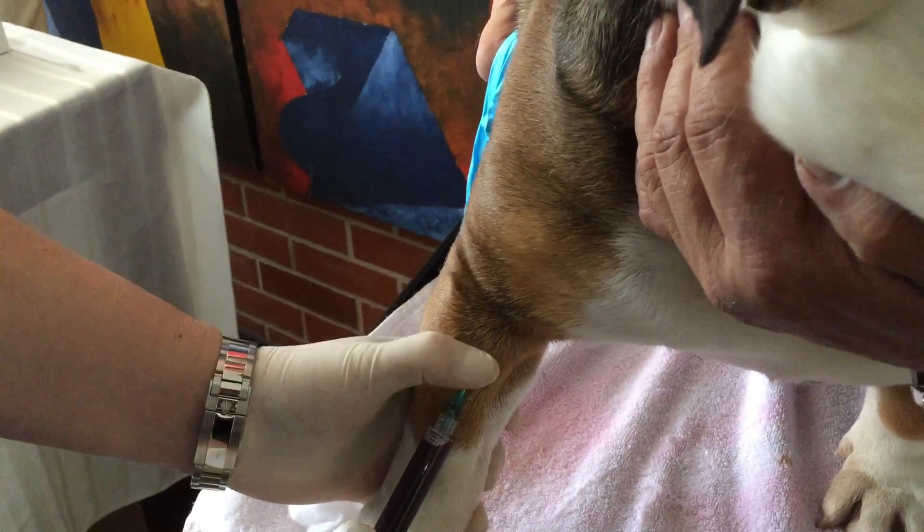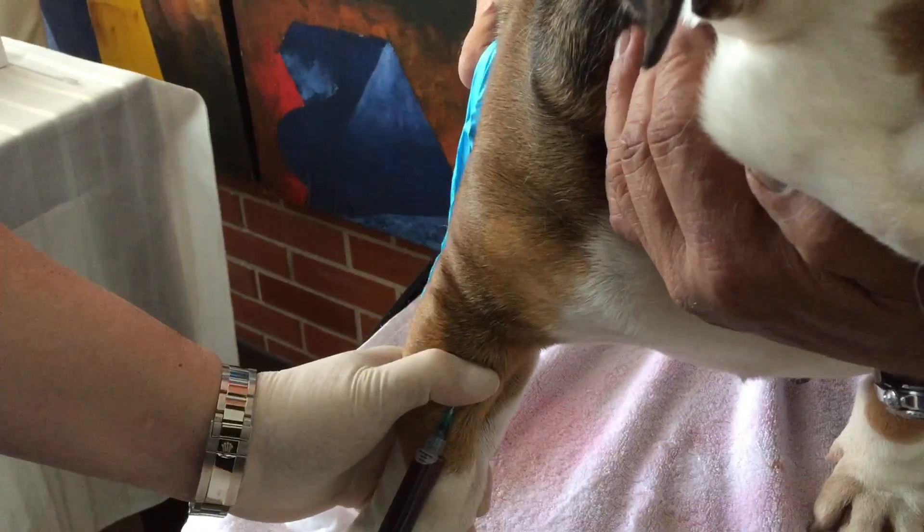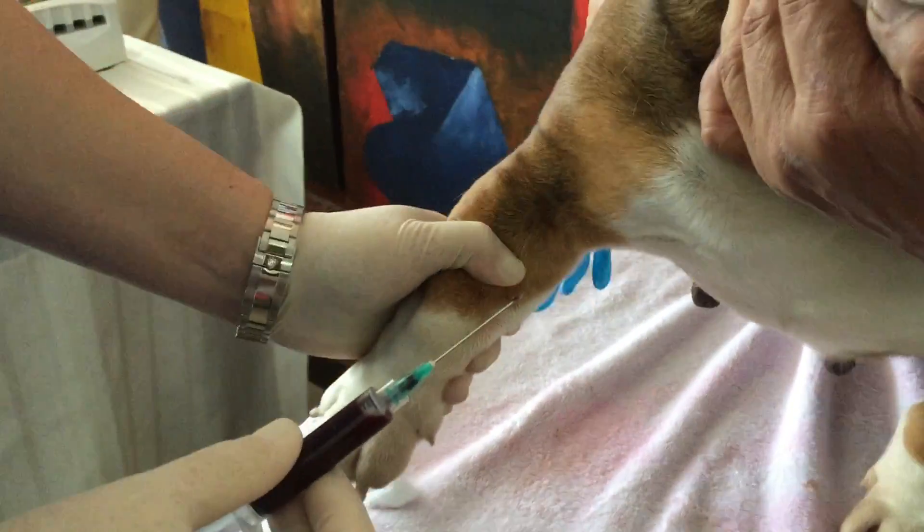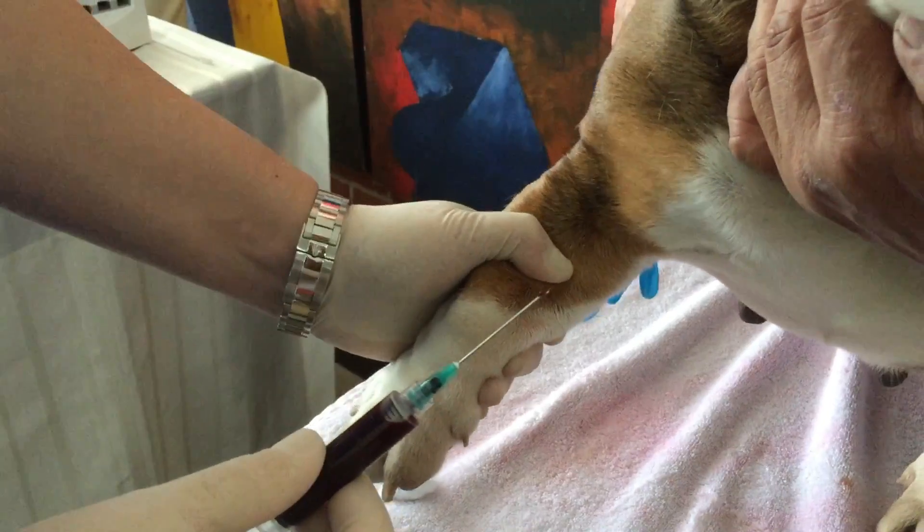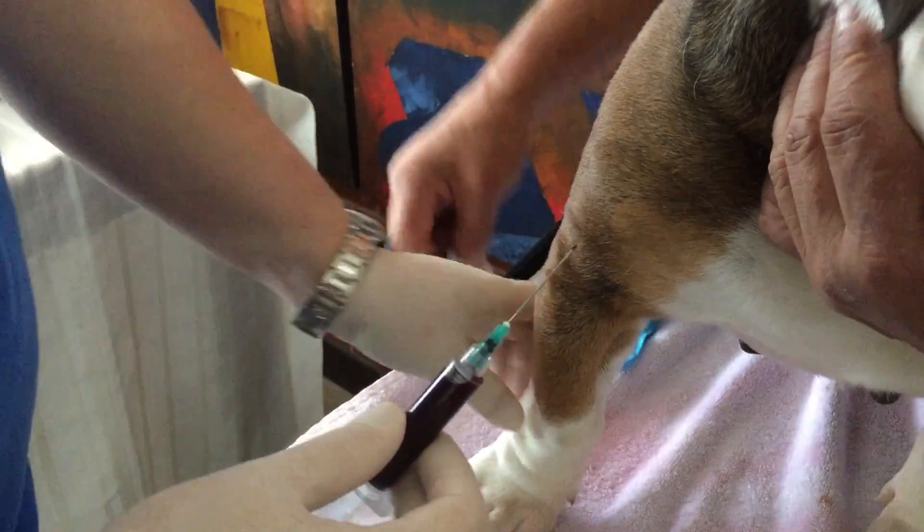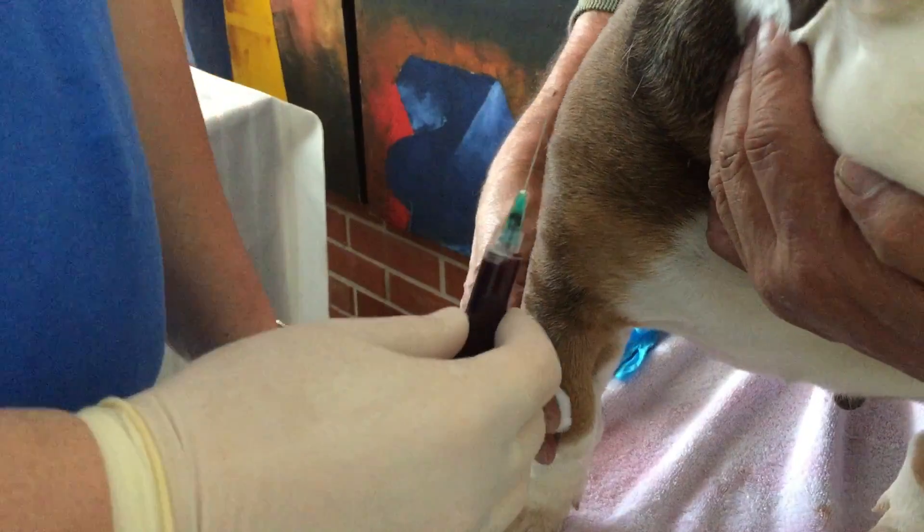You don't want to push it hard. You just leave it there and pull the needle backwards. Then you press here so no blood comes out. And that's it. Let's go spin this blood.